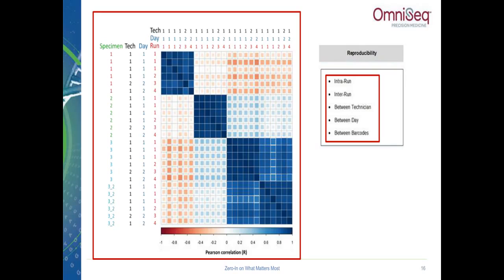And you can see how we've had different technicians, different days, different runs. And we used 3 different specimens plus a replicate of the 3rd specimen. And you can see the concordance is outstanding, and it's even really good for the replicates of specimen 3.